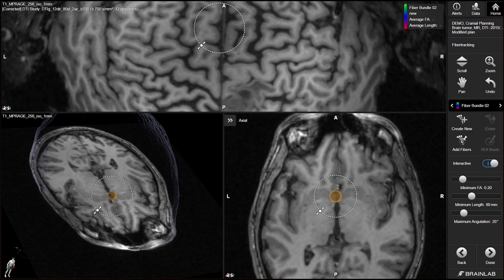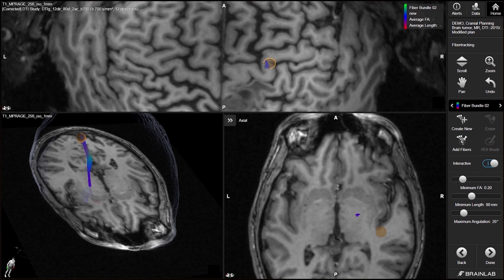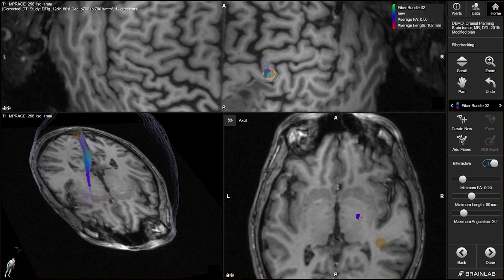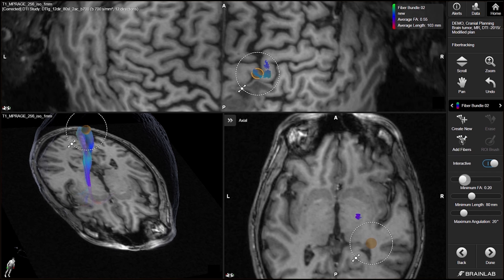Dynamic Live Tracking in 2D, 3D and Brain Projection View is another unique option for quick, interactive fiber visualization. Changes due to adjustment of one of the tracking parameters are also instantaneously displayed.